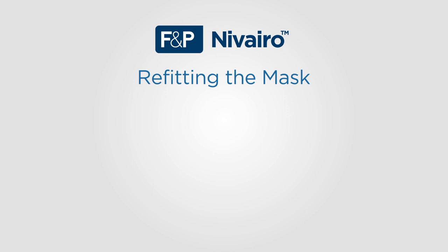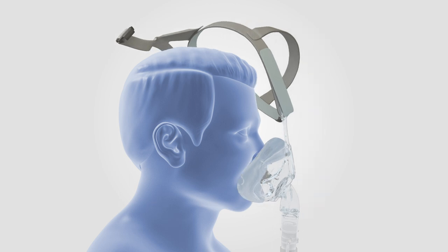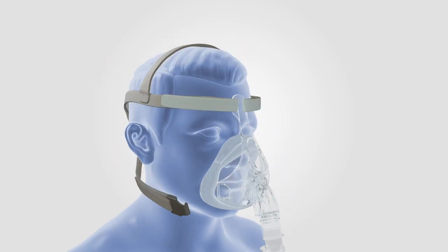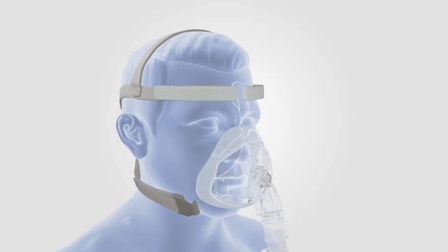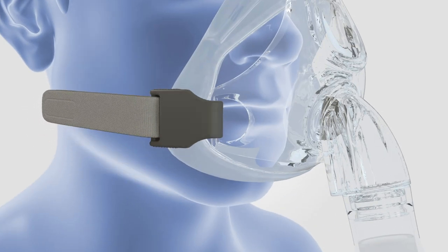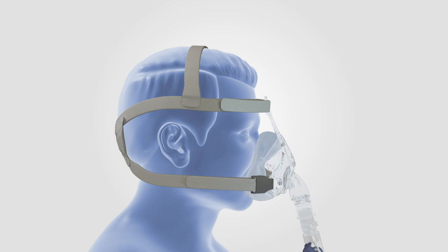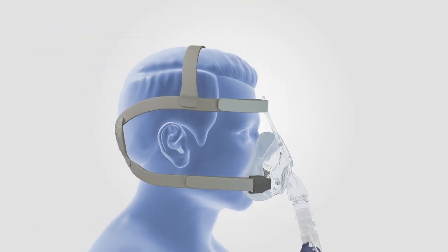Let us now look at how to refit Navarro full face masks. To refit the mask, place the seal under the lips and lightly touch the mask to the bridge of the nose. Slide loose headgear over the back of the patient's head. If the patient has a gastric tube, ensure it sits under the tube fit zone. Reconnect the headgear clip onto the mask chassis. By refitting the mask using the headgear clip, there should be no need to readjust the headgear. Gently pull the entire mask forward, allowing the seal to inflate so it can adjust to the patient's face to minimize leak. Gently release the mask.